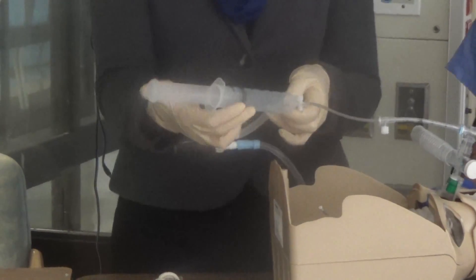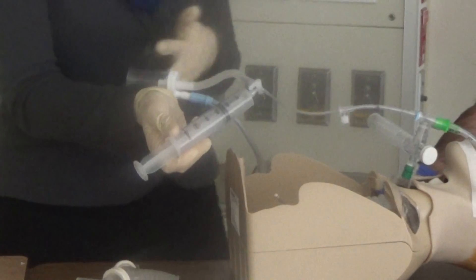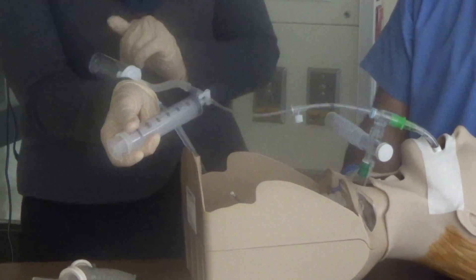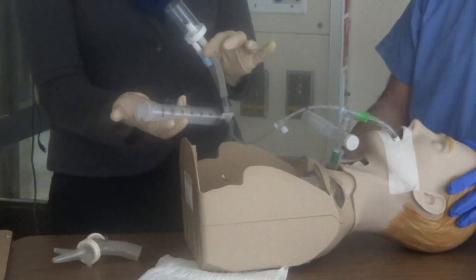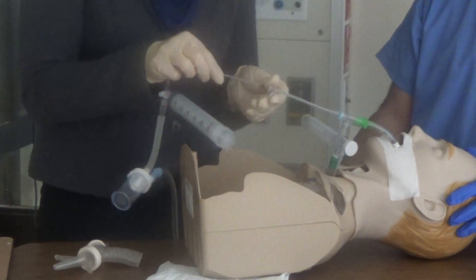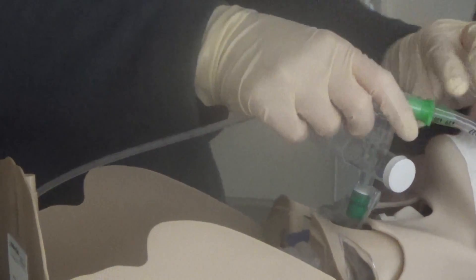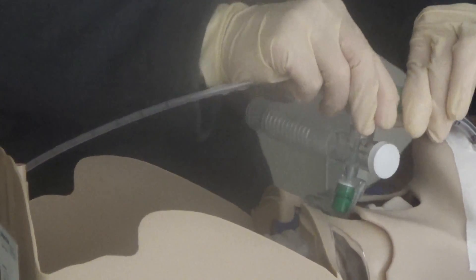With suction in the off position, I'll go ahead and give aliquots of 20 mL. After giving 20 mL, I'll turn my stopcock to saline off and suction on. Since we haven't received a sample yet, I'll instill 20 more mL — suction off, give an additional 20, then saline off and suction on. By this time you should have more than enough sample collected in your specimen jar. Once both RTs agree there is adequate sample, terminate the procedure by simply pulling the catheter out.